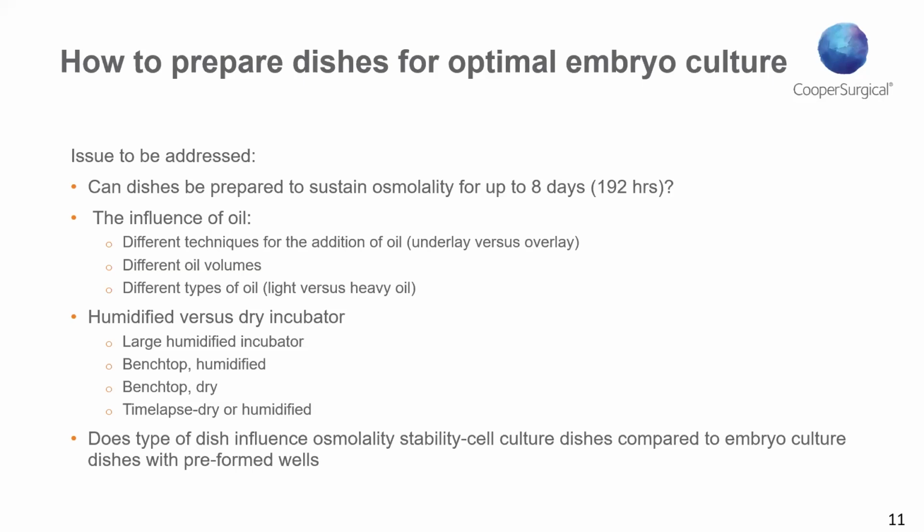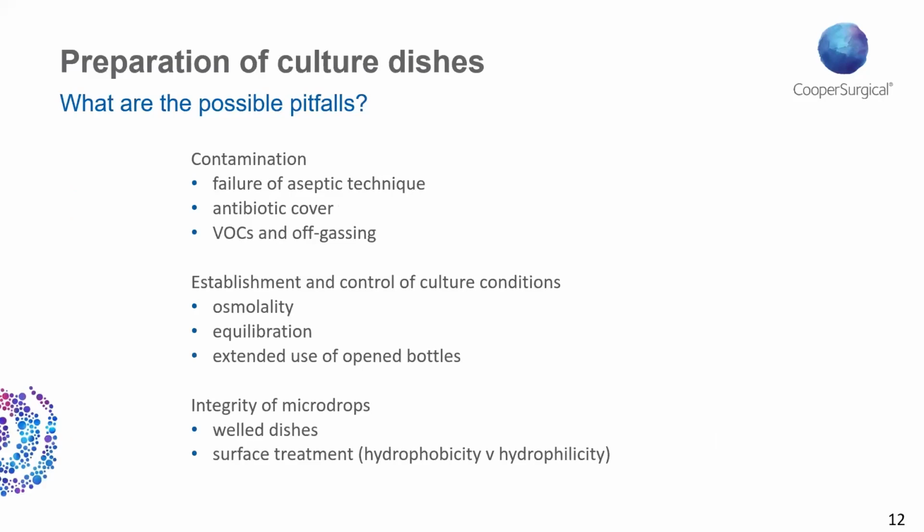Okay, so what are the possible pitfalls of dish preparation? Contamination. Again, in the early days of IVF, when we were culturing in tubes, we didn't use oil.